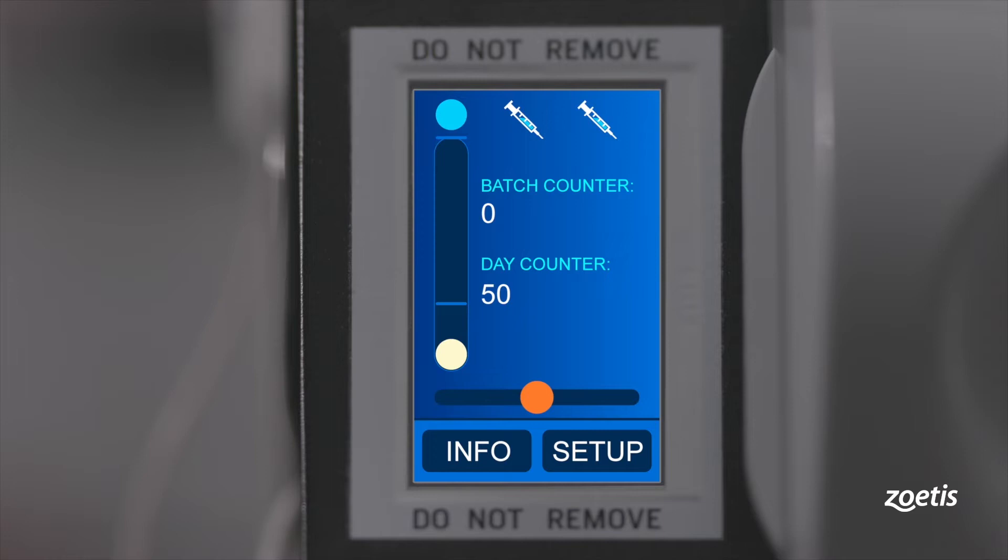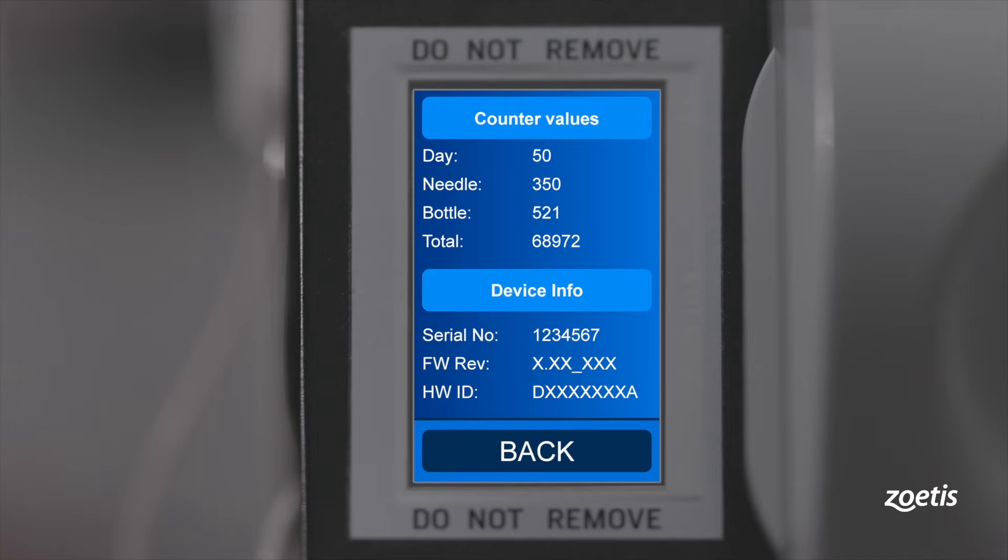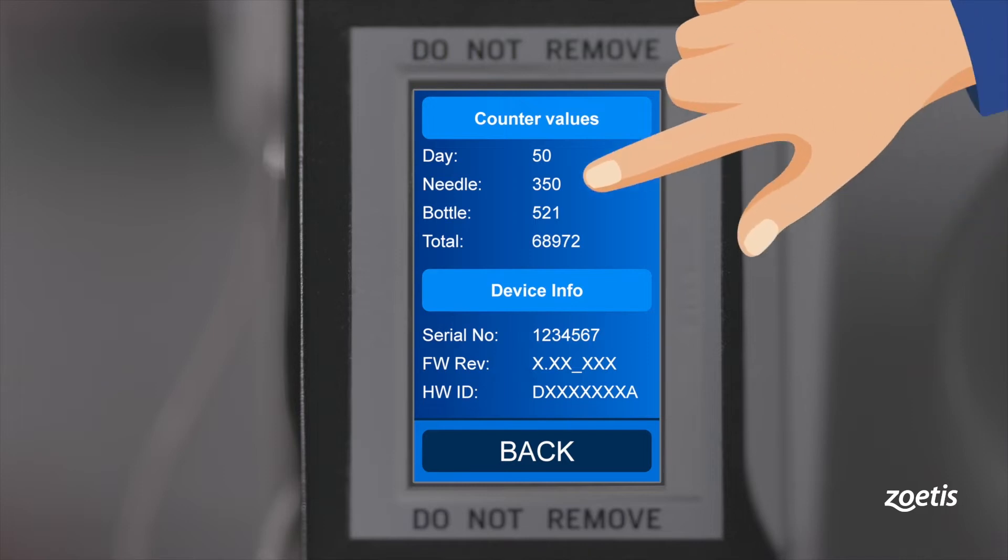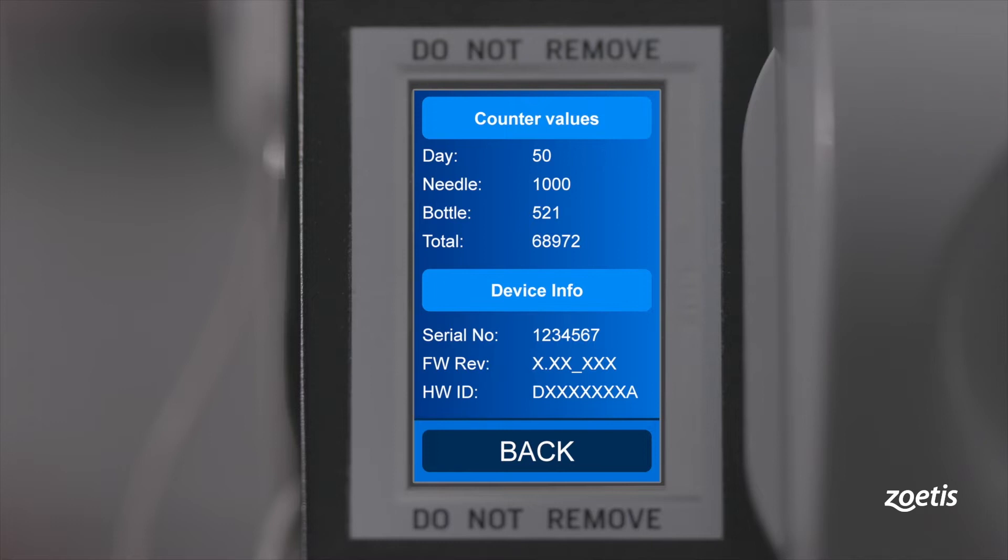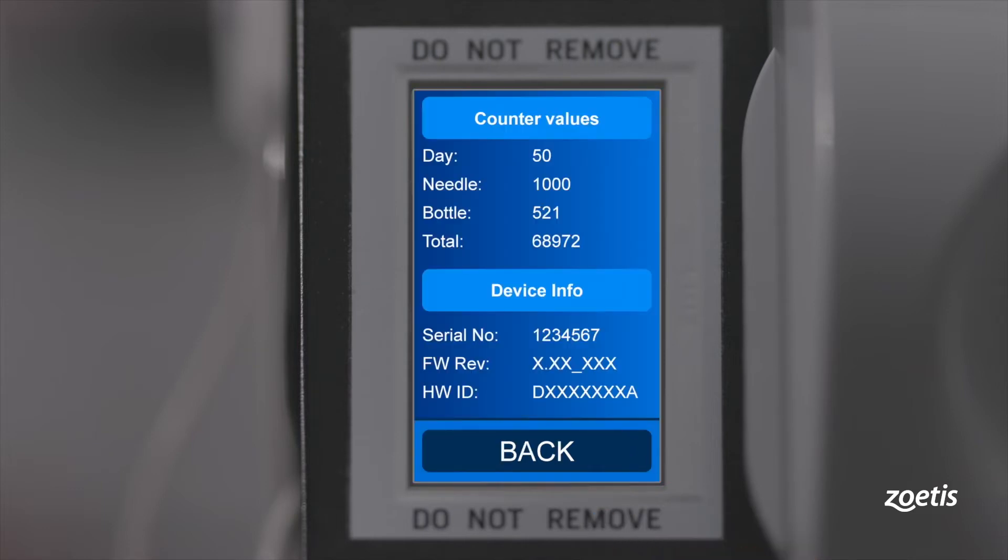By pressing the info button, you can get detailed information of your device and its status. Needle counter indicates the number of injections given since the last reset. After 1000 injections, the needle counter will request a needle change, which is indicated on the touch display. Confirm the warning by touching OK. Change the needle and reset the counter to zero to continue operation.